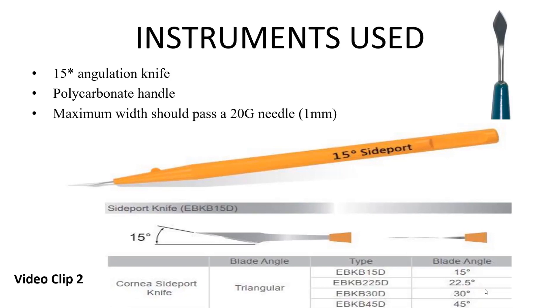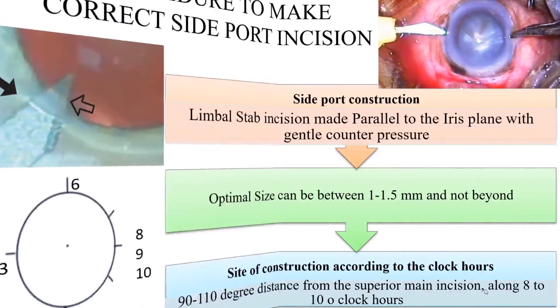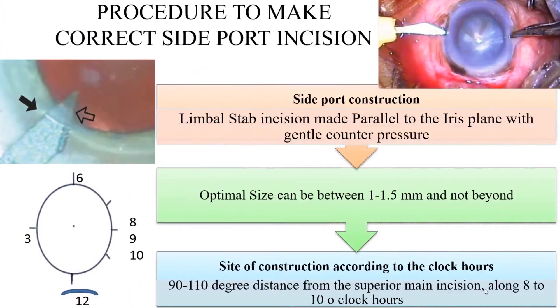The maximum width should allow passage of a 20-gauge needle, that is around 0.9 mm to 1 mm. For the proper procedure, a limbal stab incision is much preferable to the clear corneal stab incision. It should be made parallel to the iris plane with gentle counter pressure from the opposite side. The optimal size should be between 1 to 1.5 mm.